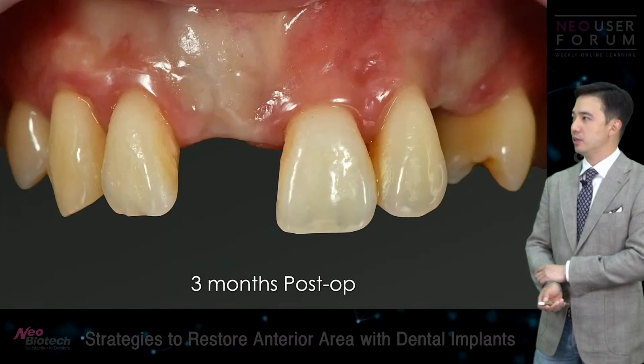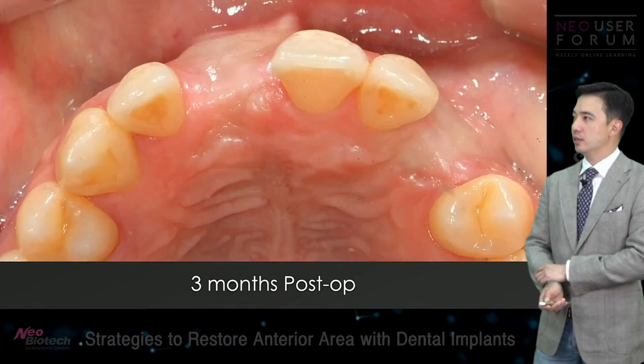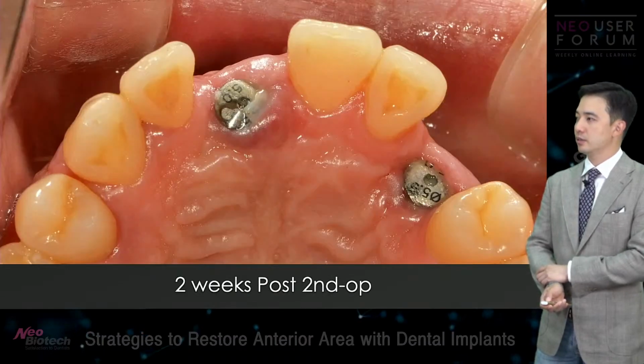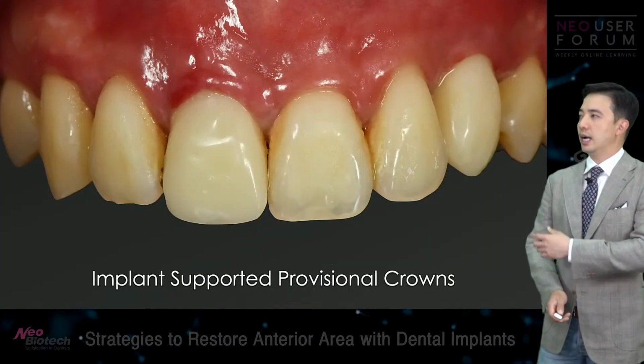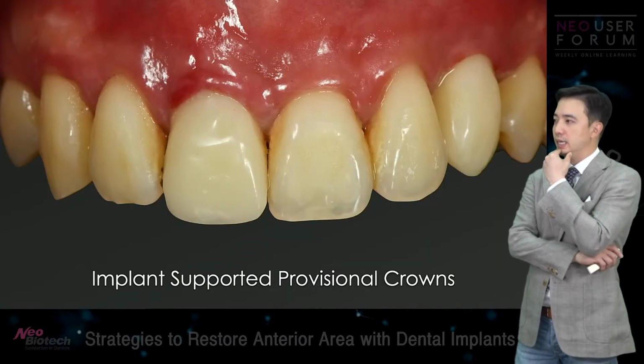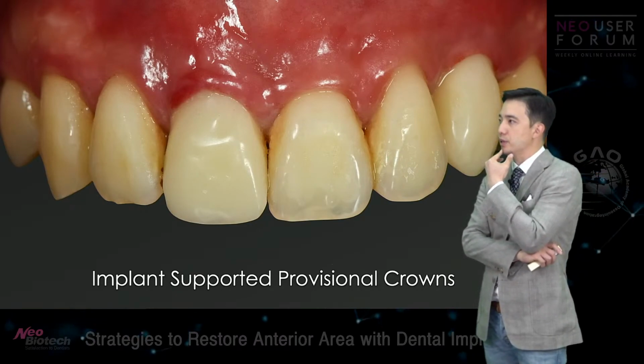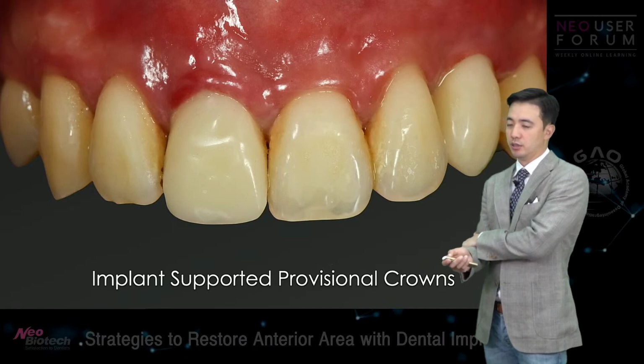So a provisional RPD was delivered. Three months post-operation. Yes. So for this case, implant supported provisional crowns were also delivered.